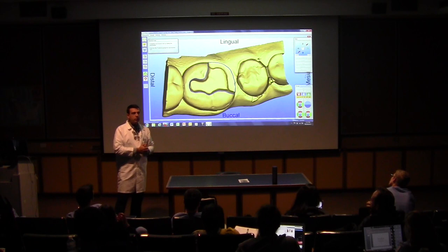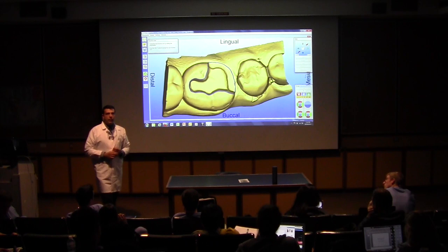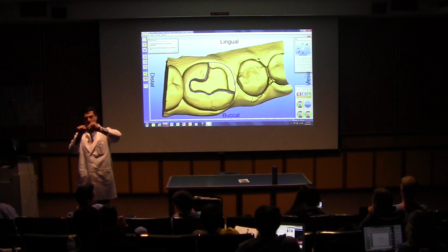Yep. So when you are rotating the image on the computer, there were yellow spots, but they went away because you rotated it? Keep in mind that sometimes the way you take the 3D image, because let's say this is my molar, this is my bicuspid, right? Let's now change the clinical situation. Now this is my molar, and this is my bicuspid. Okay, so my molar is tilted.